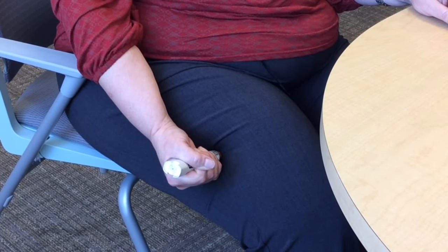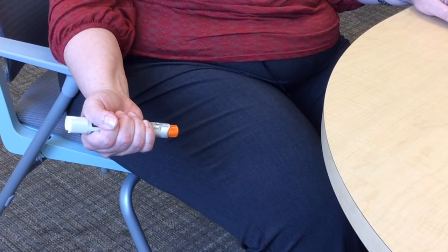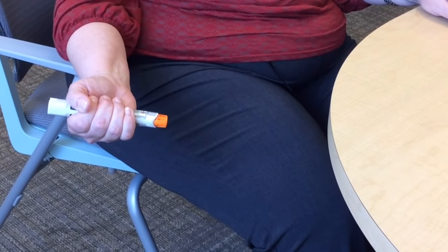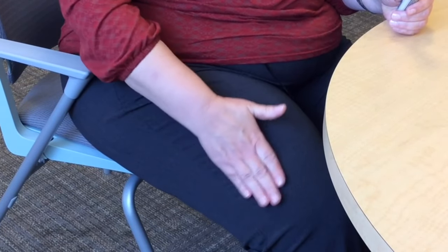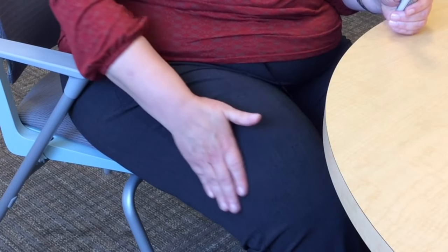One, two, three. The injection is now complete and you can remove the auto-injector from your thigh. The orange tip will cover the needle. Massage the injection area for 10 seconds and call 911. Do not try to reuse the auto-injector.